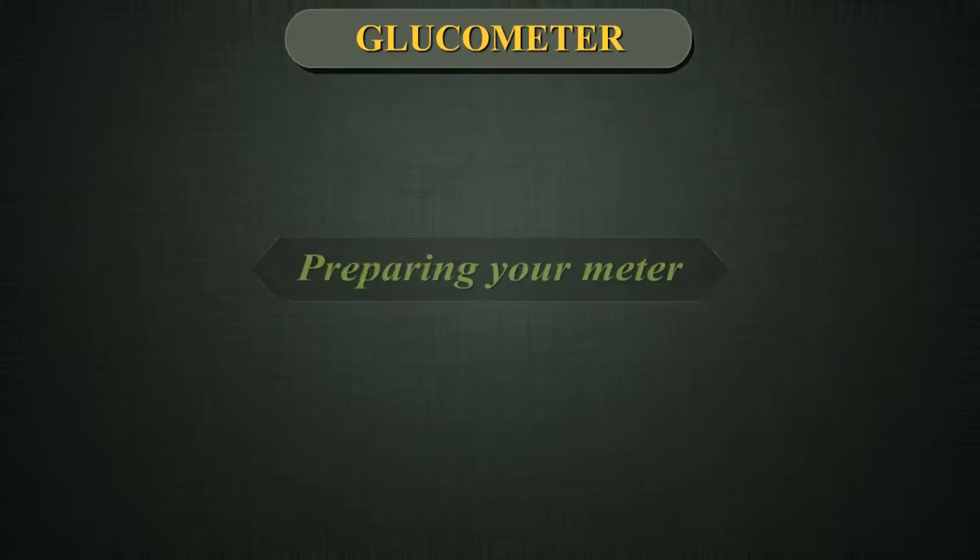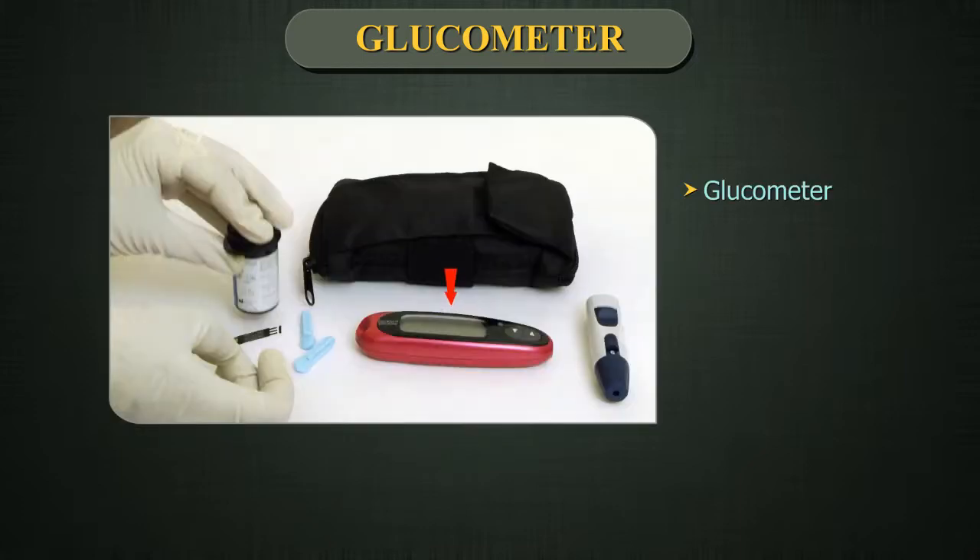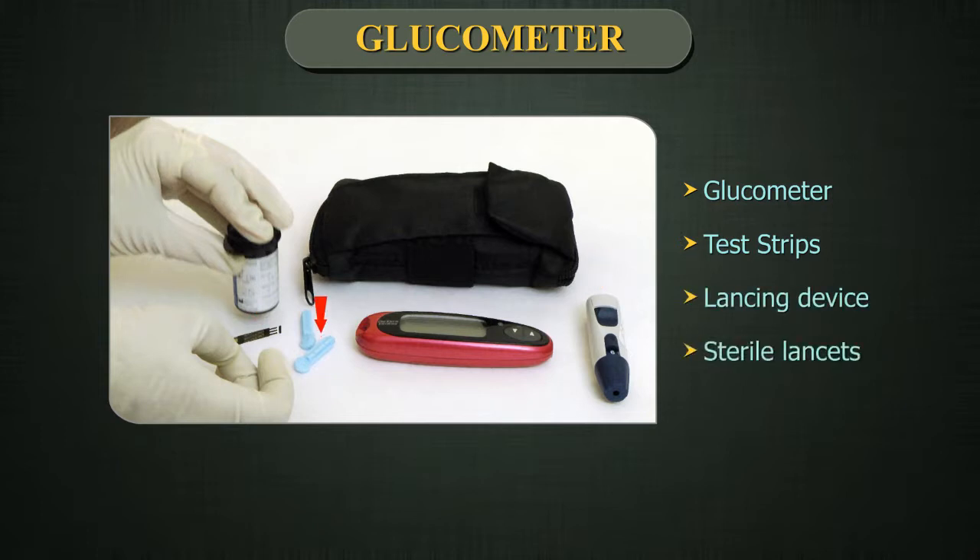Glucometer. Preparing your meter. Have the following things ready when you check blood sugar level: a glucometer, test strips, a lancing device, and sterile lancets.